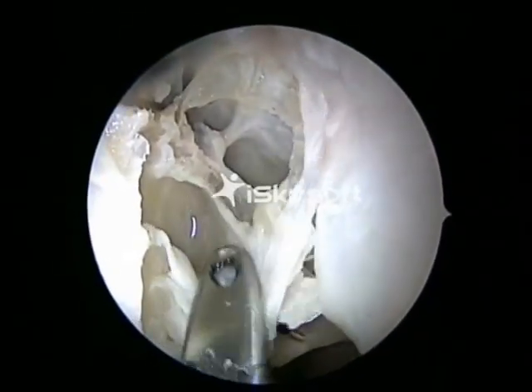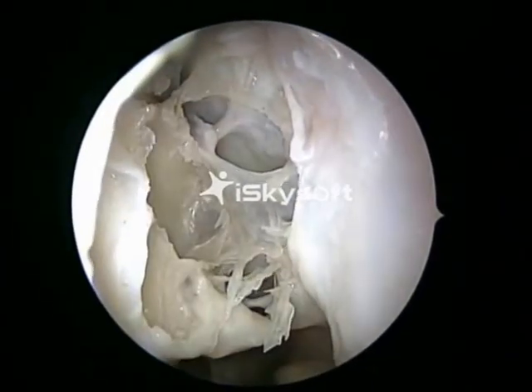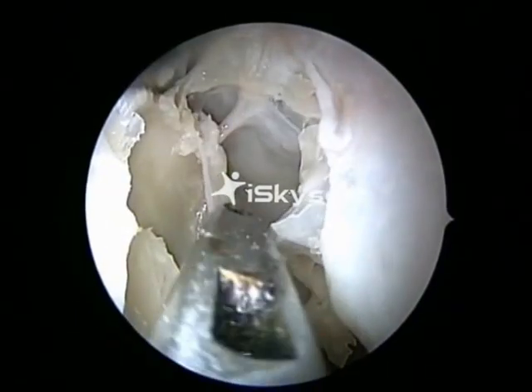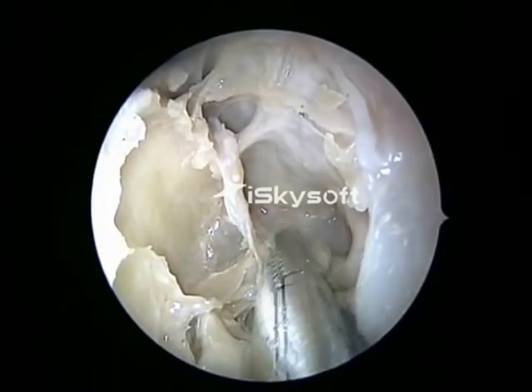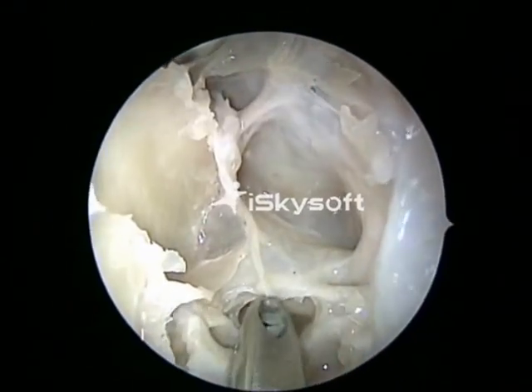In this cadaver, we will be actually shearing the mucosa out, but in a live situation, we would like to preserve the mucosa. We take off the mucosa here to just demonstrate the anatomy. That's yet another cell in the posterior ethmoids.